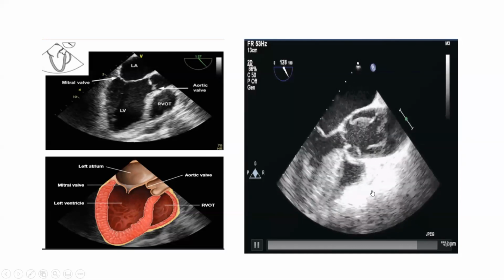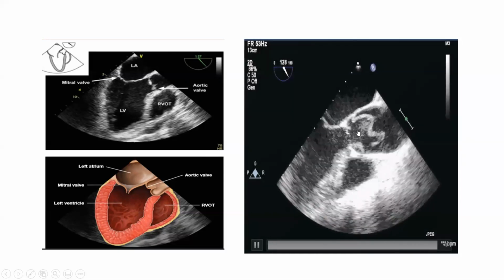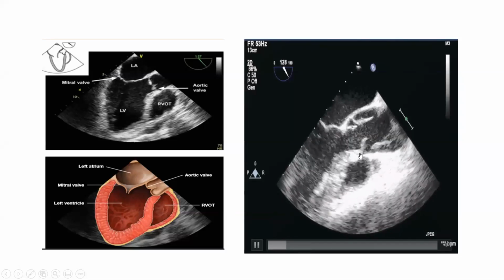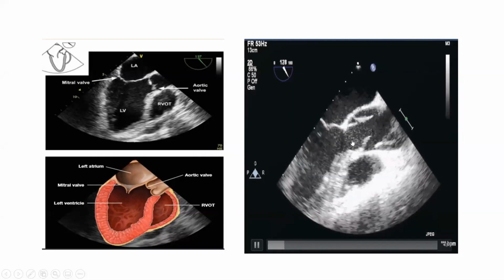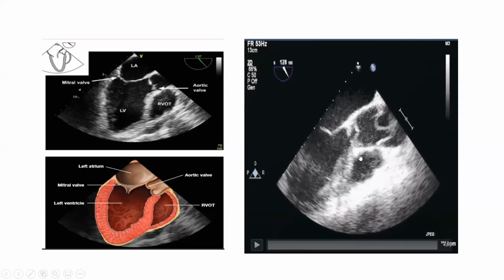Sorry for the bad views here. Why? Because it is in the OR. The patient came acutely. They pushed him to the OR, and they found, of course, the transthoracic shows something. So they proceeded, of course, to CT. And after CT, the patient was pushed directly to the OR, and they found this dissection flap, and he went for surgery.